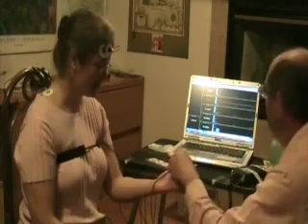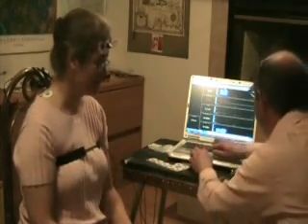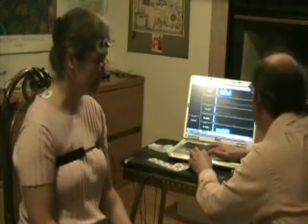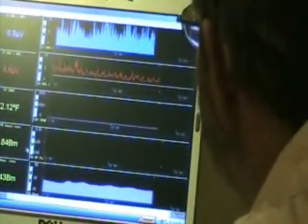So now let's check. Just put your hand down. Let's check to see if we're picking up a heartbeat. So that's the next signal down. It's showing that your heartbeat is about 66 to 72, 73, something like that.